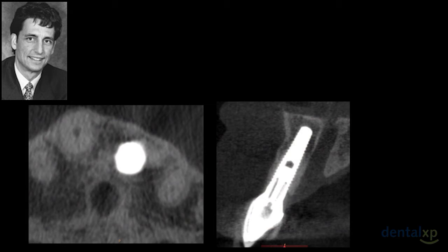This is, the patient came back for another need, and we went ahead and took a CT scan. This is about 4 or 5 years later, and we're still seeing fairly good dimensional stability in a case where we had a very tight dimension, as you can see.